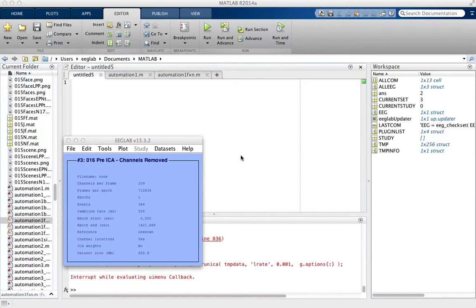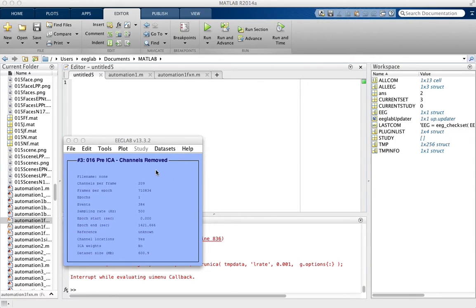This is how to run ICA. I already have uploaded my files, removed the channels that I didn't want, and filtered the data, which is really important. You have to filter the data before you run ICA.